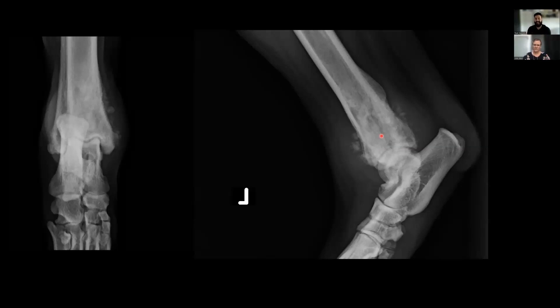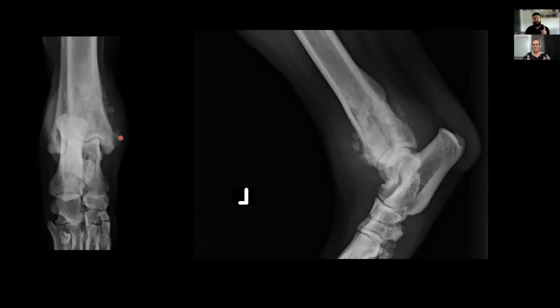Whenever I see a periosteal reaction, the key question is whether it is smooth or irregular. In this instance we would call this an irregular periosteal reaction, especially on the lateral projection — there's an undulating, almost spiculated appearance to the cranial aspect. It is super irregular along both the cranial and caudal aspects, and similarly along the medial aspect. Irregular periosteal reactions are an indication of an aggressive bone lesion.